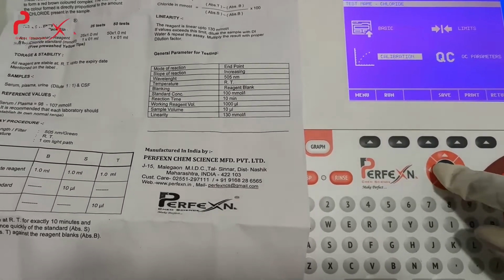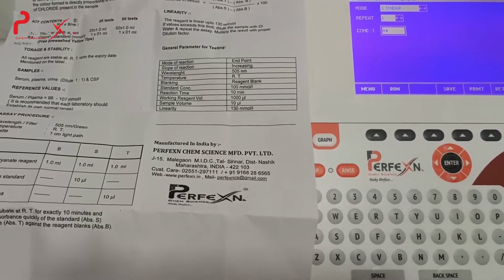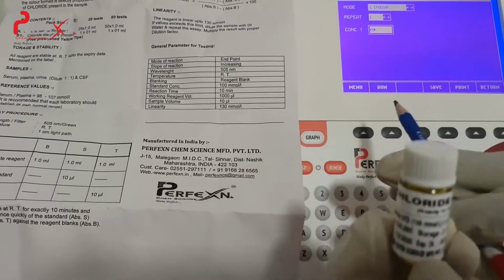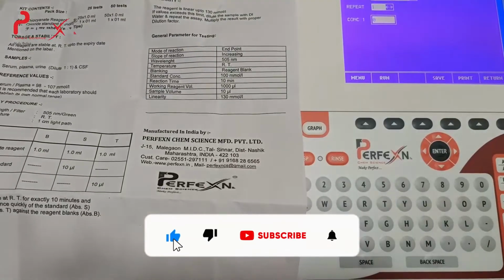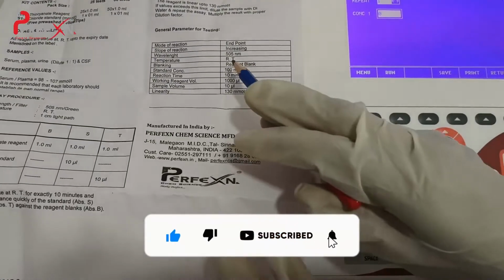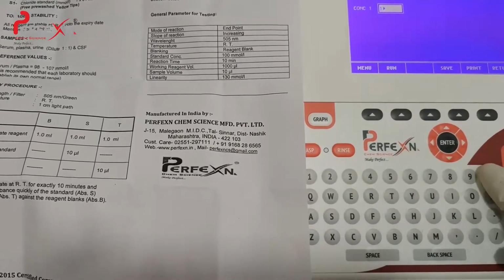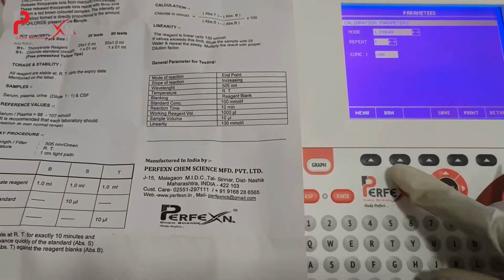Now go for the calibration, enter it, and we have to enter the concentration of the standard. You will see on this vial they have given 100 millimole per liter, so we have to enter 100 millimole per liter. So save it and run for the test.